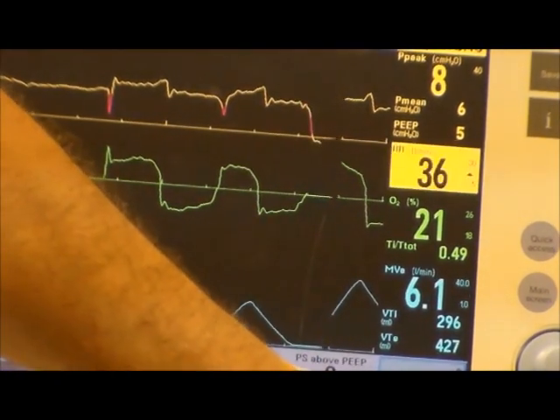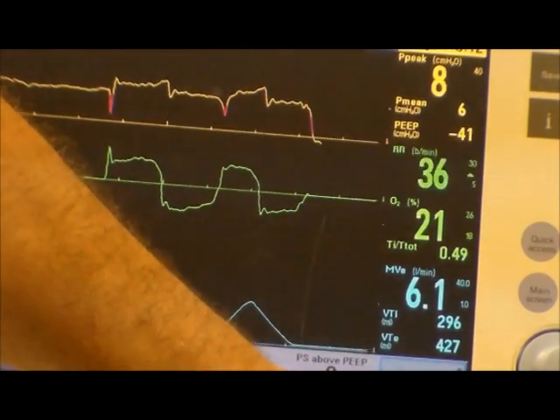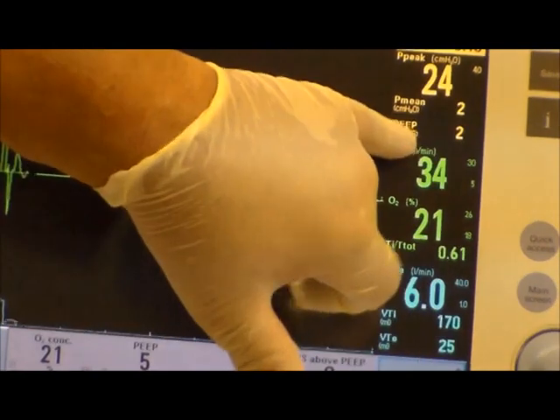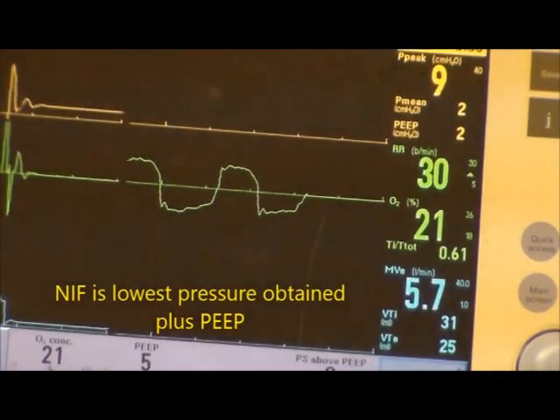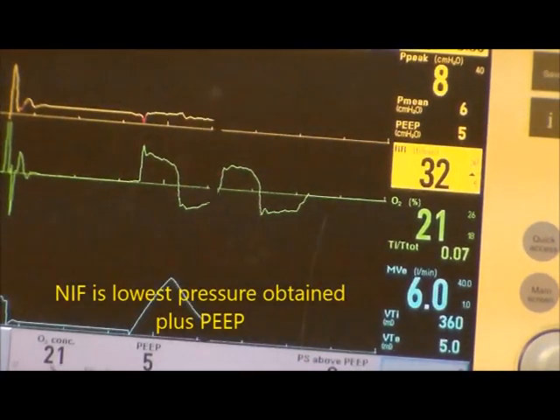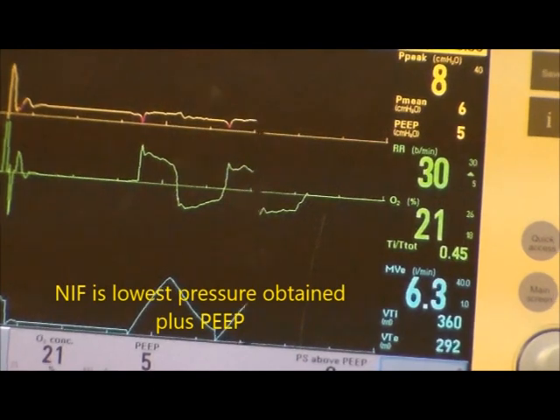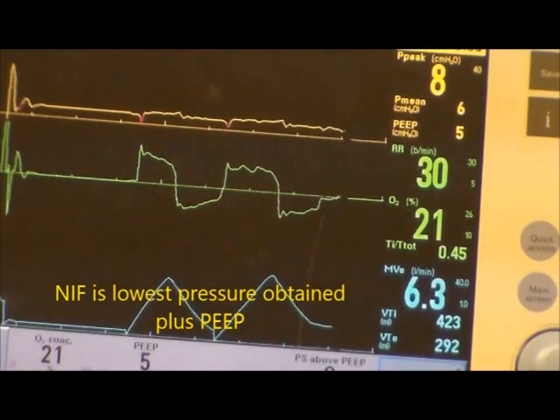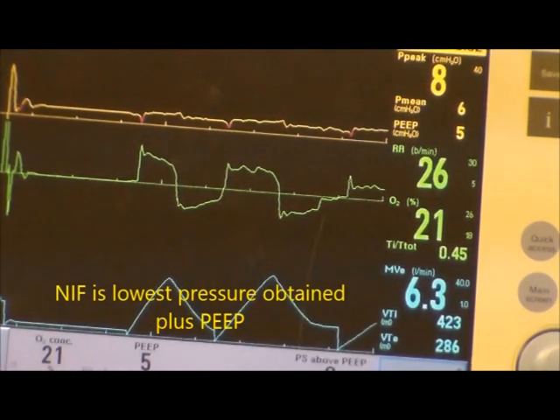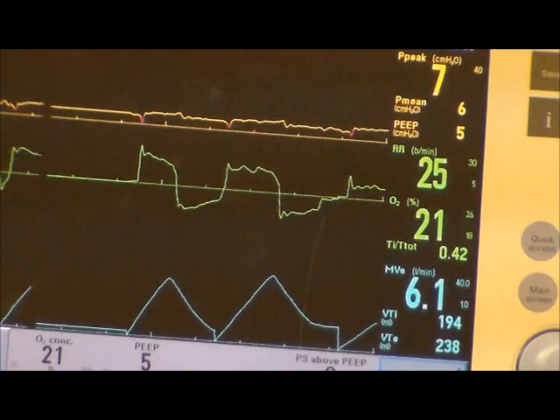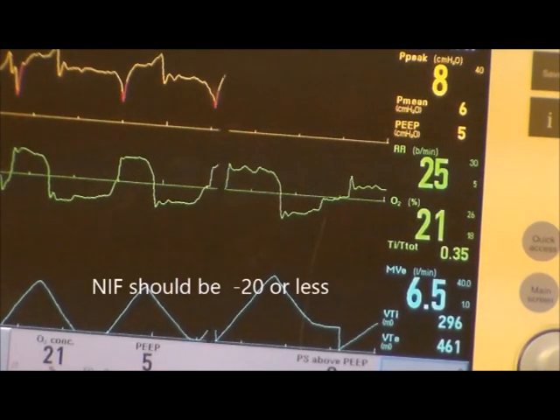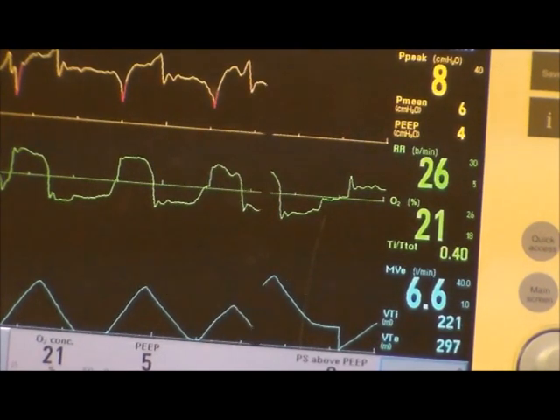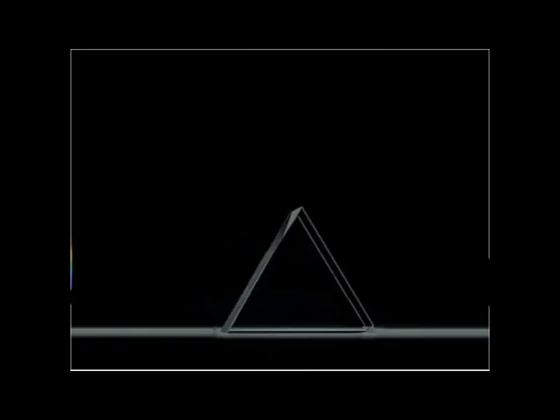You're going to hold it in, tell them to suck in real hard, and get your value — negative 41. You want to remember that you need to include your PEEP, so if you're already on five of PEEP, your NIF is actually negative 46. Remember that for the NIF you want it less than negative 20 centimeters of pressure, so the more negative the better.